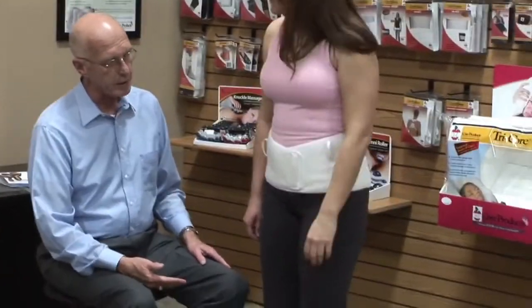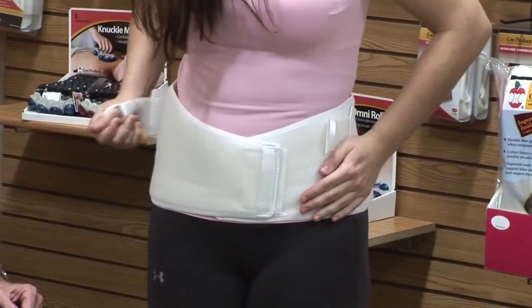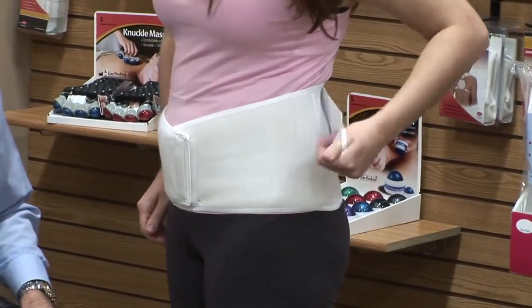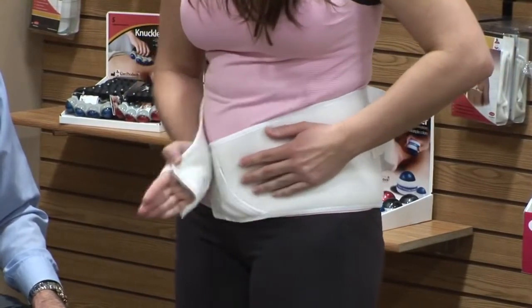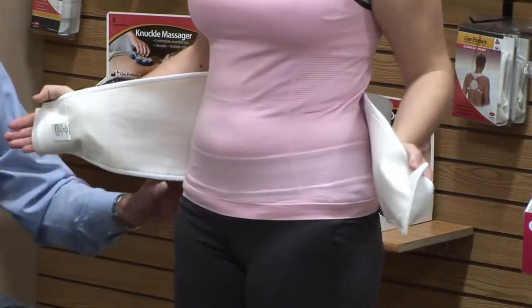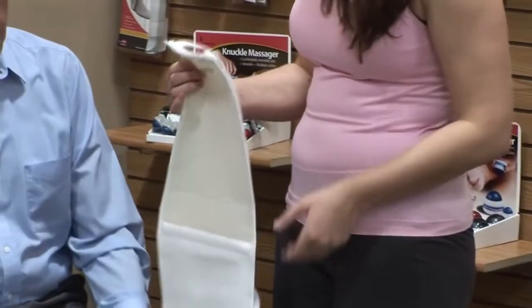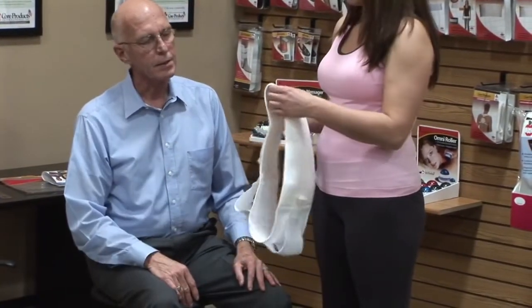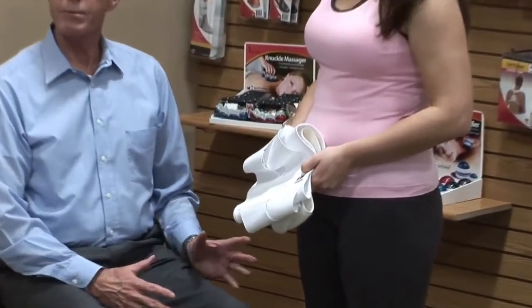Now we ask the patient to take it off. Remove the cinch tabs first — they just peel off — and place them to the very back of the velcro material, in front of the elastic. Then take the anterior panel off. Teach the patient to touch the velcro down so the hook doesn't get caught on anything and tangle up. Now the patient has taken it completely off.